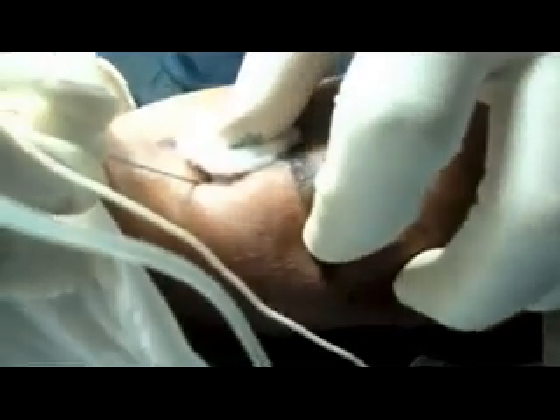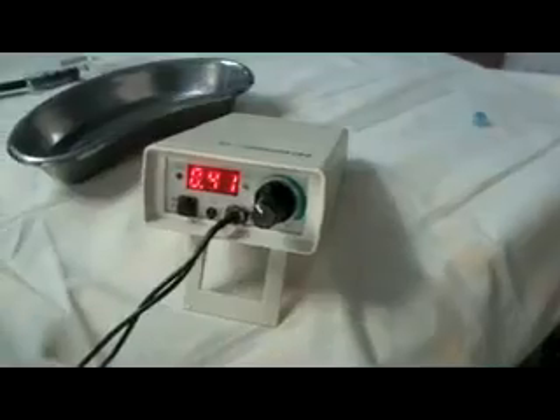If you give the local anesthetic here, the block will not work. We need thumb extension — you can see we are getting the thumb extension. Reduce the current. We're still getting thumb extension. This is the radial nerve stimulation confirmed.